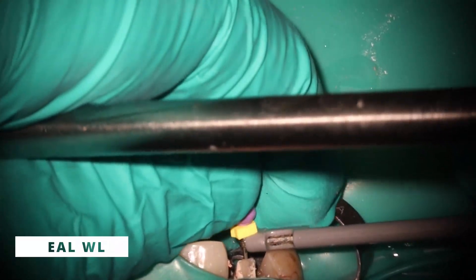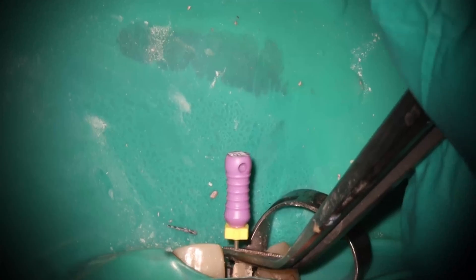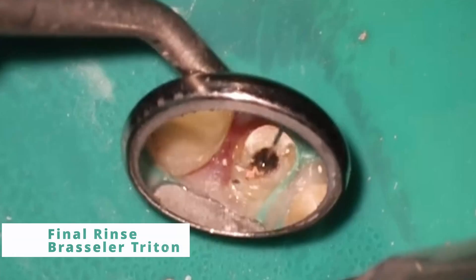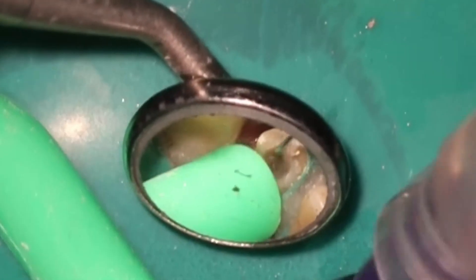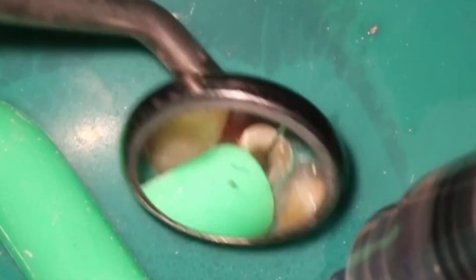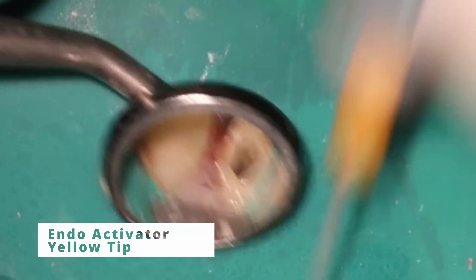I've skipped over a lot of the rinsing. I did put the total treatment time in here too. I wanted to show with working length how I'm using the screwing-in motion to get a very accurate working length. I will be using a cone for this case because the size was a little bit larger — the squirt fill needs a more confined space, and because the post drill was so large, it really isn't a great situation for a squirt fill. Here we are finishing up with the final rinse with the Triton. The patient was asymptomatic, but with how much work had been done inside, especially once I saw it was thermophil, I wanted to make sure she had a good foundation to build the new tooth.